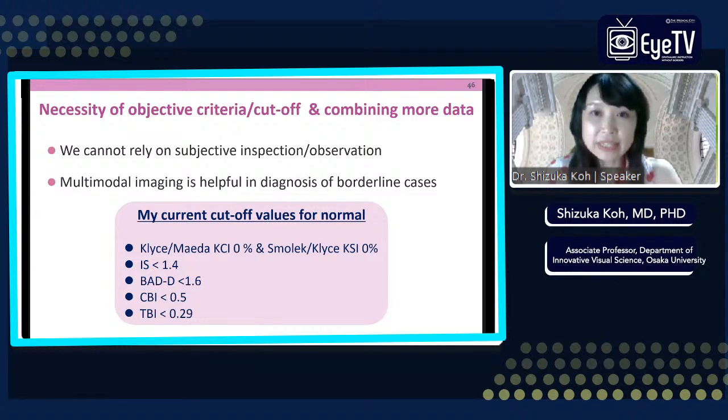Multimodal imaging is helpful in diagnosis of borderline cases, especially. Also, we perform the questionnaire for keratoconus-related risk factors. Shown here are my current cutoff values for normal.